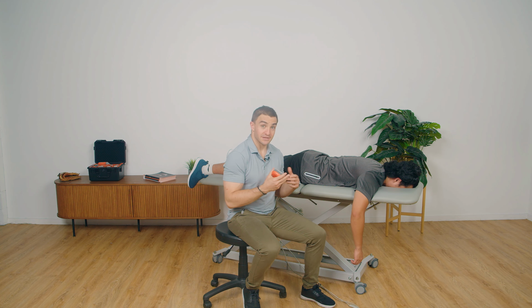So what I'm trying to determine is the maximal amount of force that Cal can apply before the external force overcomes his ability to stabilize that joint segment. As we saw in the last video where I was assessing Cal in a standing position, there's a lot of additional movement, especially when I perform the break test. What I want to do is ensure that I'm just measuring force of Cal's external rotators as best we can. So we want to avoid additional movement.